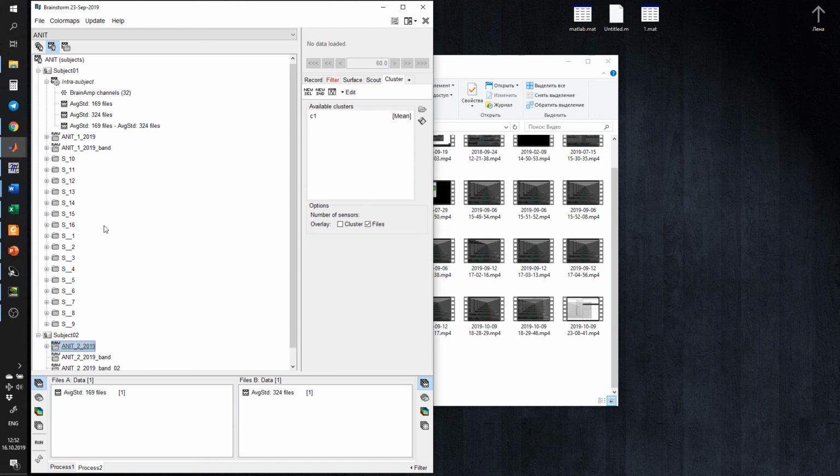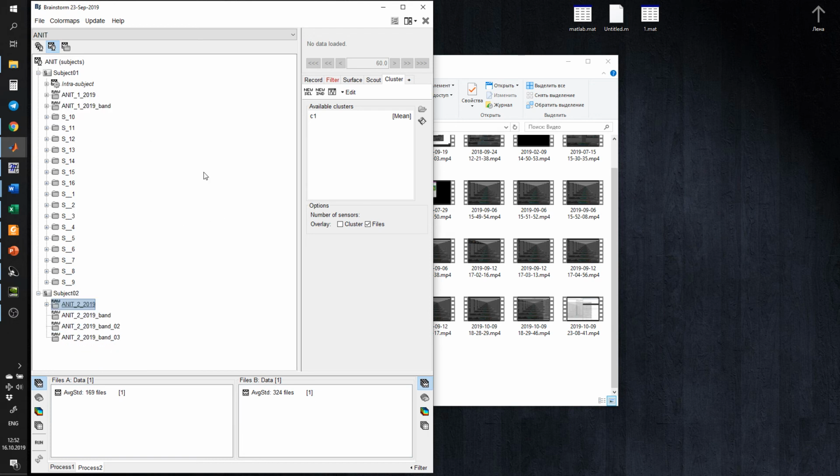For subject 1 I want you to import events from 1 to 16, then average them as I showed, and then subtract them from one to another. And then please create an ERP and try to superimpose ERP of one condition over the ERP in the other condition.